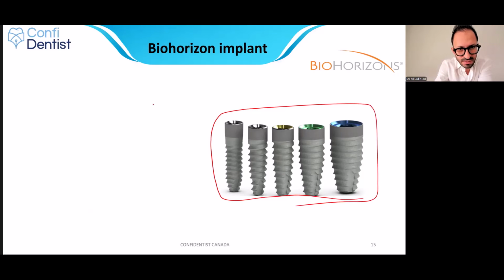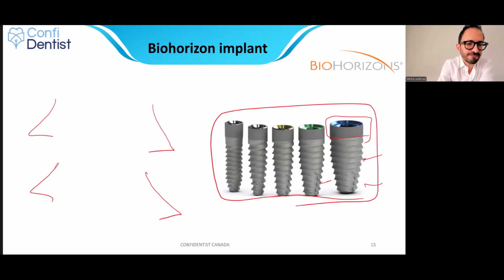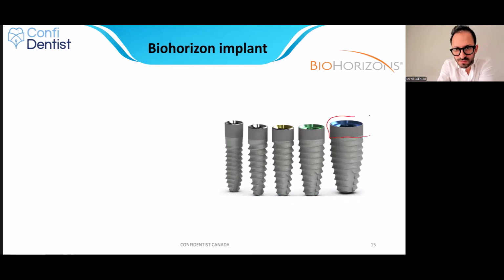If you look at the threads, they have this design, the active threads, and the coronal part. You see these micro threads. Some of them are laser coated, or laser treated. It can be a little bit confusing sometimes, okay?